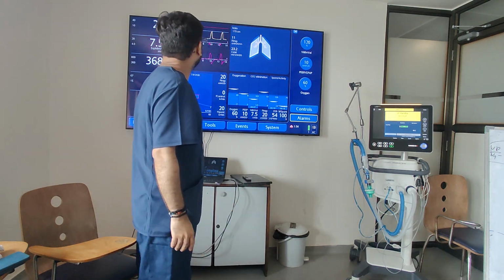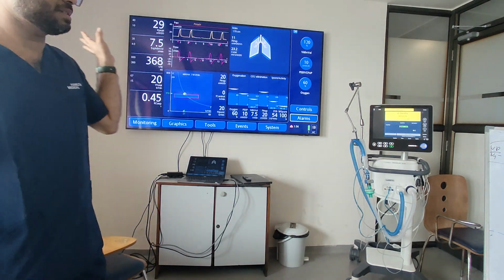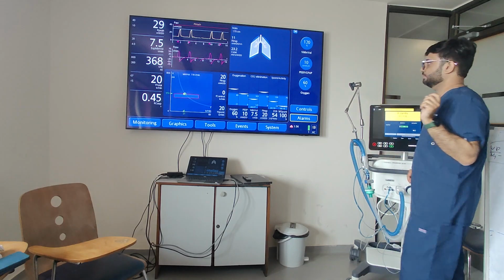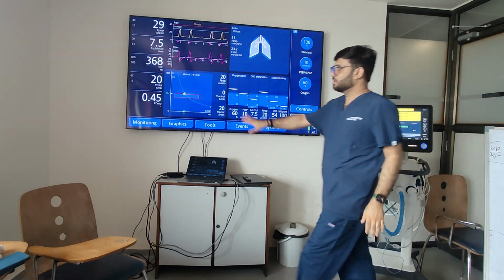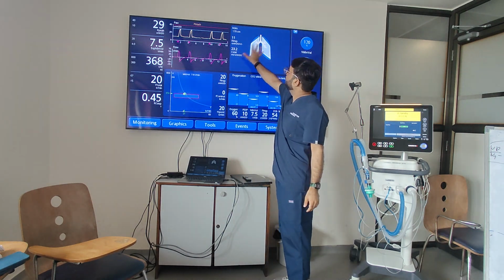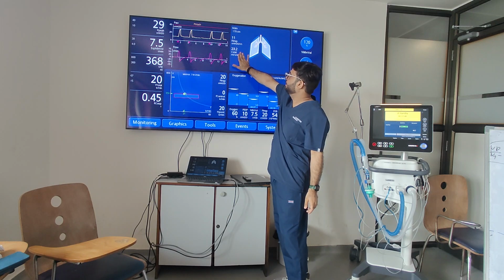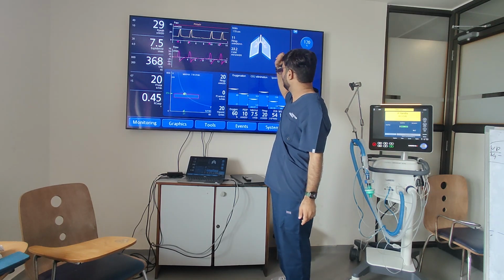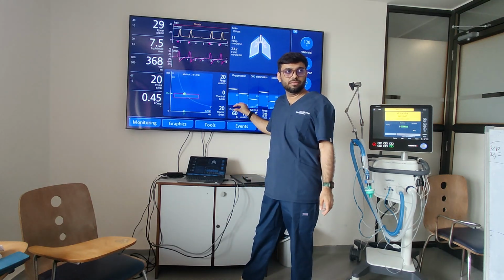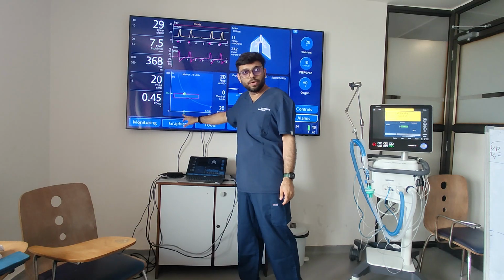So now if you see this, can you guess what exactly this is? What kind of disease is this? Exactly. So what you compared is your time constant is less. Here, if you compare the dynamic lung, this is also less, compliance is also less, and along with that, if you see the ASV graph, it has made a low and wider window and has set a target of 374 and a rate of 21.